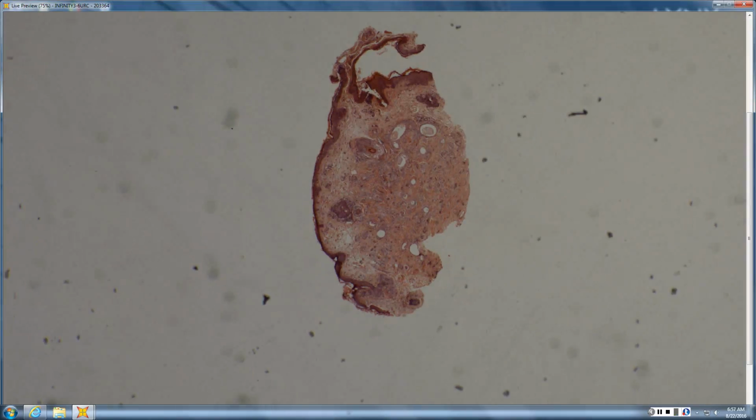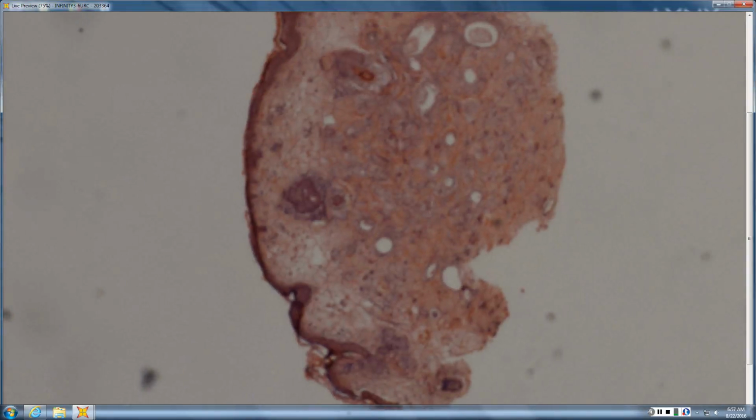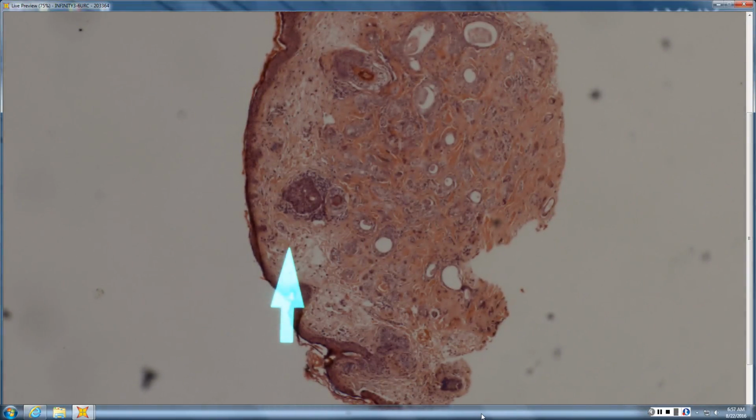So this is just a classic run-of-the-mill syringoma. If it's classic like this, you can say it's very small, very well circumscribed, with very thin overlying epidermis, because it's probably from eyelid or periorbital skin, with a dense red sclerotic stroma. You can really see that stroma here.